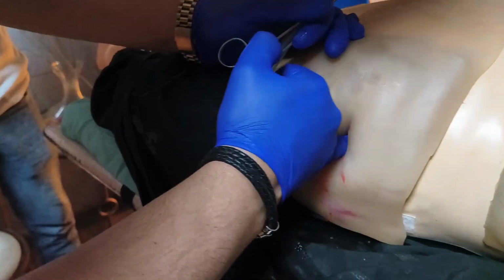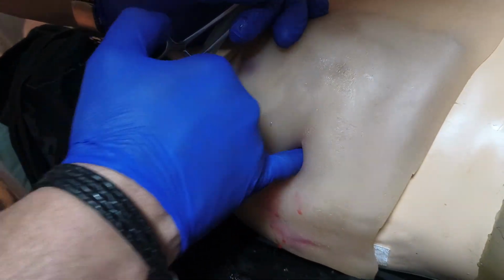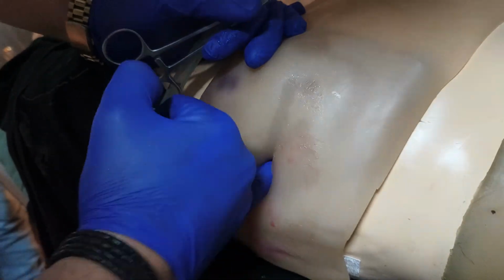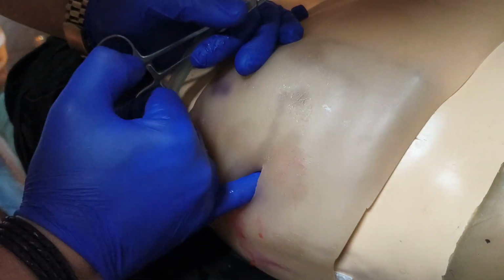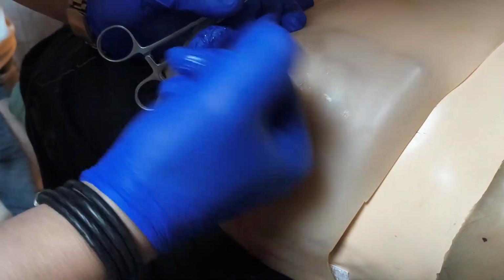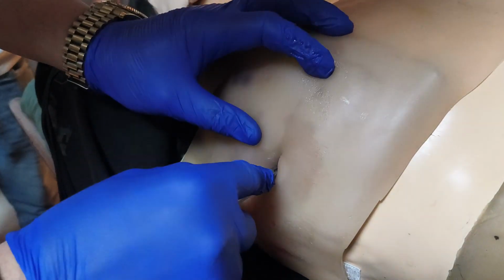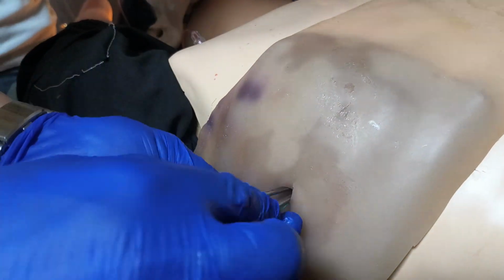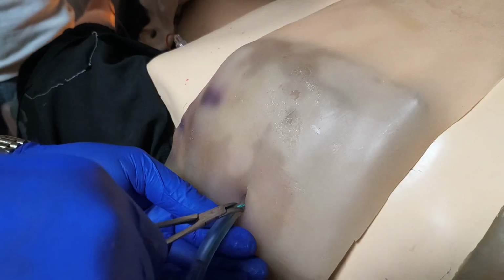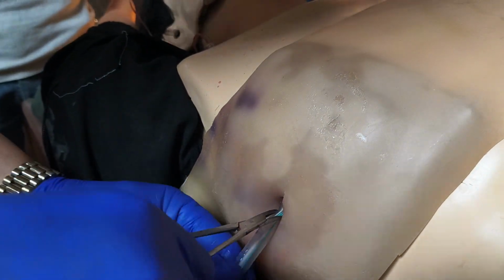Oh, before that we will do finger sweep. 360-degree finger sweep, and now we will insert the tube. Let's see. Well, this is messy. Usually I don't recommend hemothorax, but people demand, so we have it here.